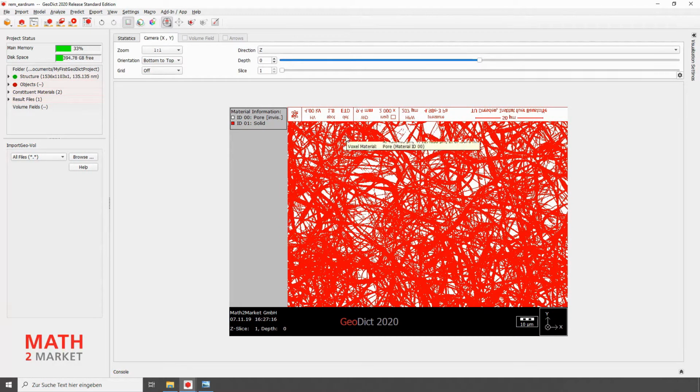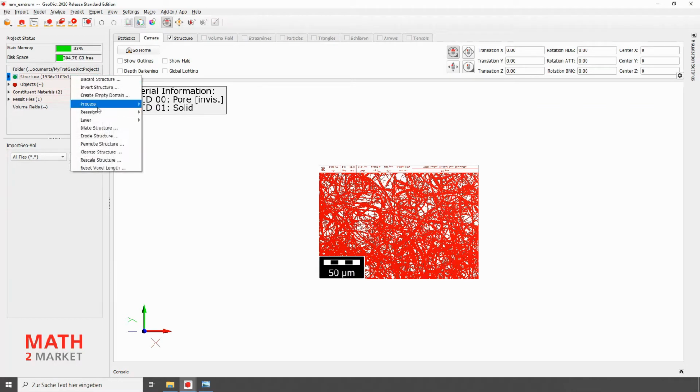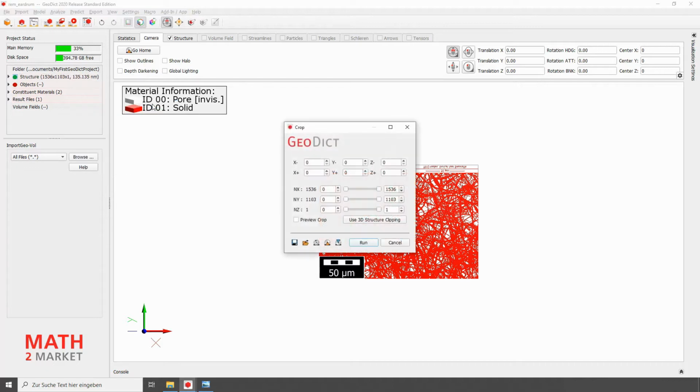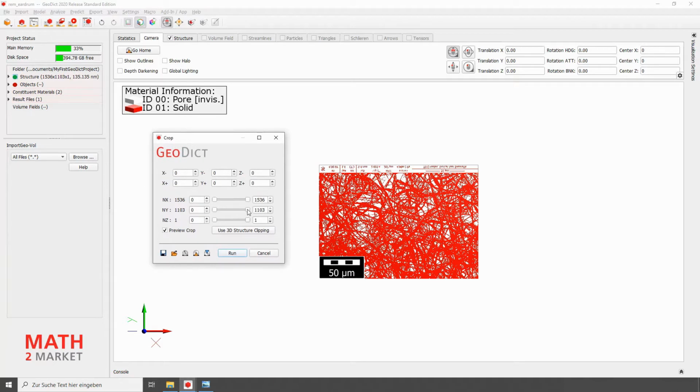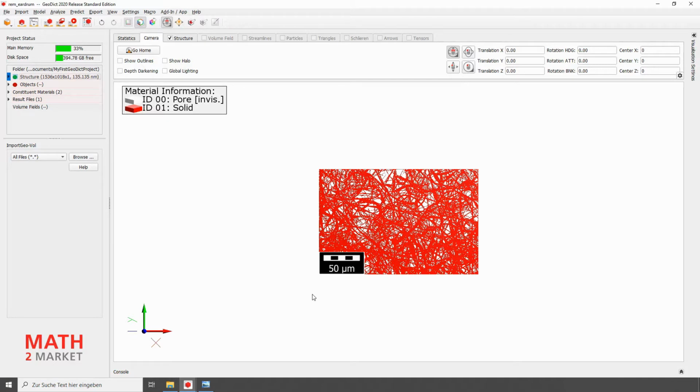First, since we want to analyze the orientation, we will now remove this bar with the meta information that was contained in the image. To do this, we go to the 3D view, select Process GeoCrop, activate the preview and lower the Y value so far that we only cut away the bar with the meta information at the top. Now we only have the fibers in the image and can perform the fiber orientation analysis in the FiberFind module.